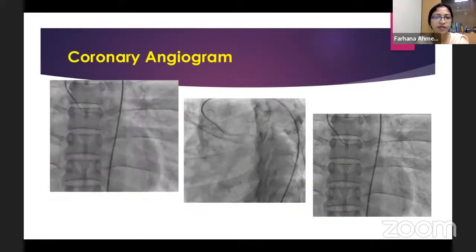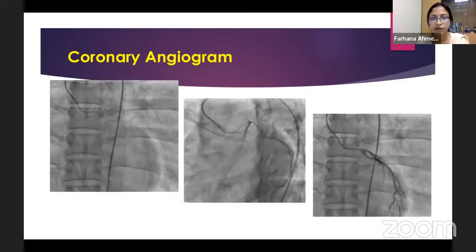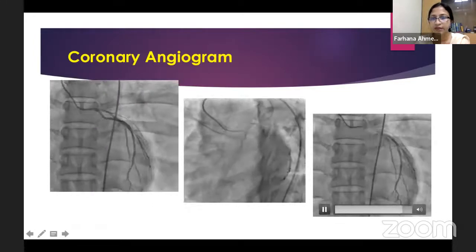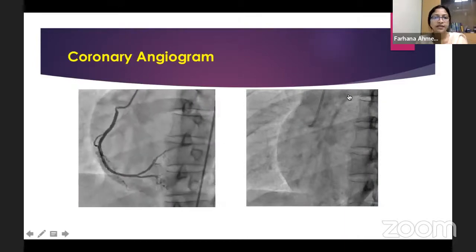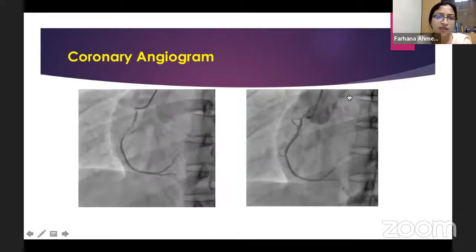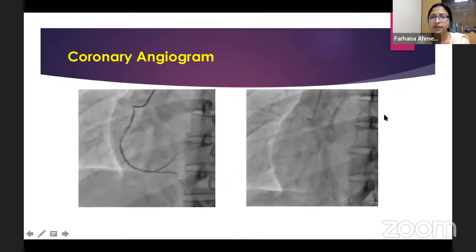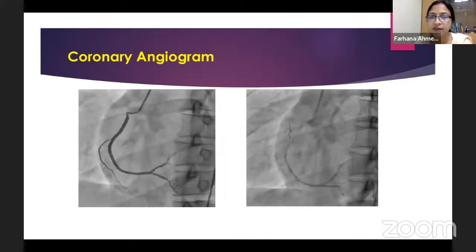There's a severe stenosis in left main ostium. Also, the left main ostium is very short. There is also disease in LAD ostium and LCX ostium is apparently clear. And right system, there is also stenosis or obstruction in proximal part. So whether it is a bioostial lesion, what is your comment for right system?